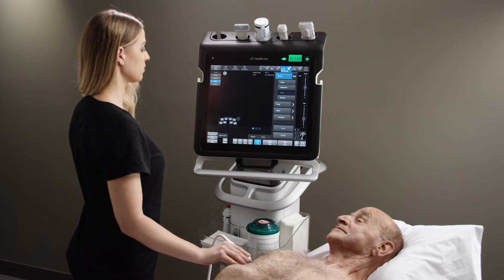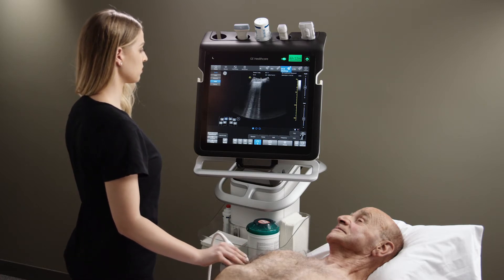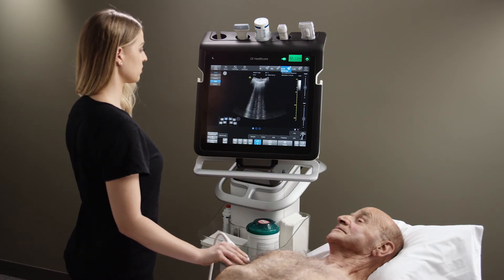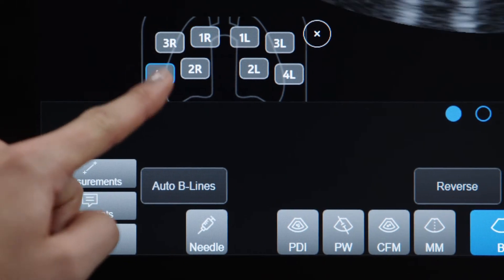When using Venue, find your standard view of the lung across the ribs or along the ribs, and select the lung segment in which you will scan.